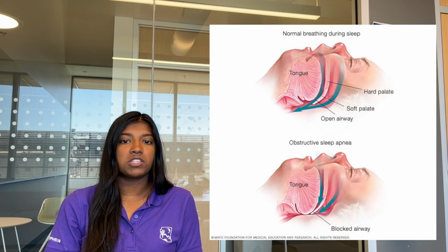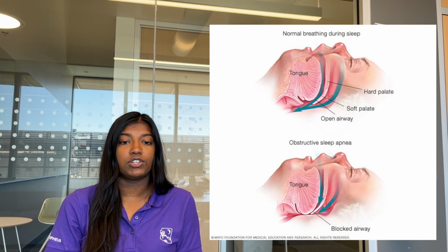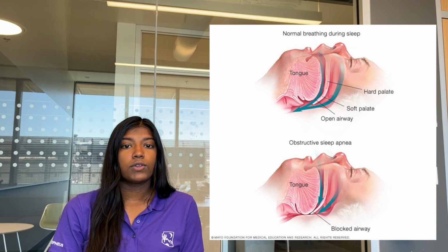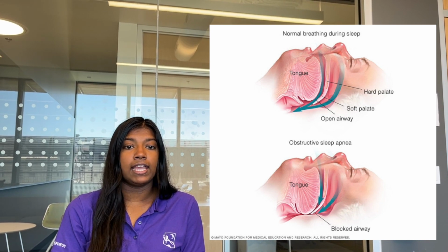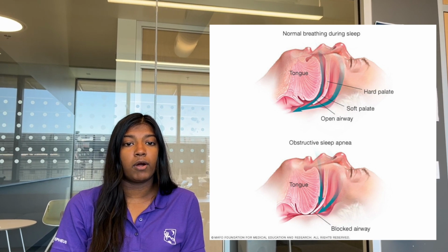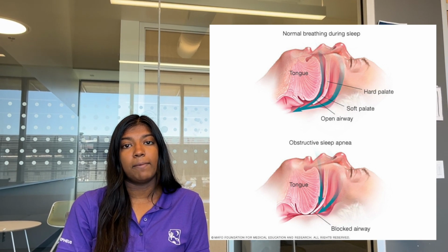Obstructive sleep apnea, commonly known as OSA, is a sleep disorder that affects an estimated 10 to 30% of adults in the US. OSA causes repeated stopping and restarting of breathing during sleep, which can lead to decreased sleep quality and potentially extreme discomfort. Snoring and its resulting patterns can be a key indicator of OSA, but these patterns can be hard to identify in patients who don't have bed partners or who can't attend in-depth lab sleep studies.